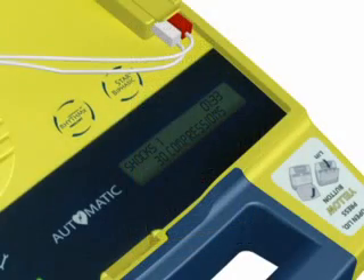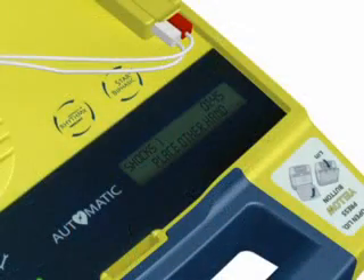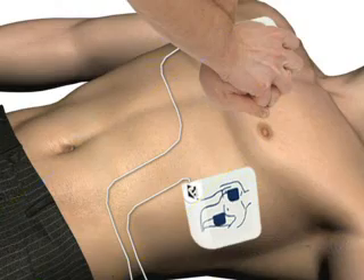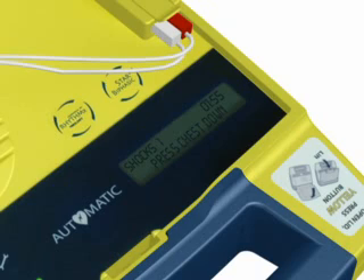When instructed, give the patient 30 rapid compressions, then give two breaths. Place the heel of one hand on the center of the chest between the nipples. Place the heel of the other hand directly on top of the first hand. Lean over the patient with elbows straight. Press the patient's chest down rapidly one-third the depth of the chest, then release.